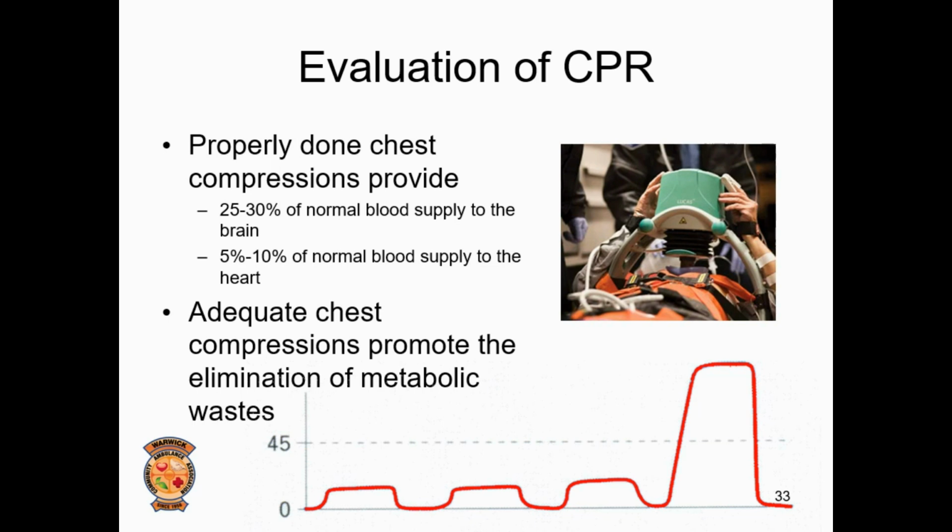So the 10% of normal blood supply during CPR is going to decrease. When that decreases, carbon dioxide being made in the cells is not getting back to the lungs to be exhaled. Changing to a rested rescuer should bring your CO2 levels back up to the normal CPR levels.